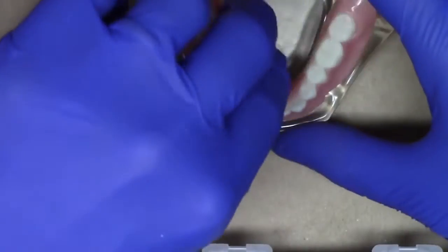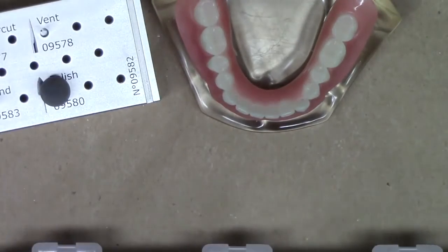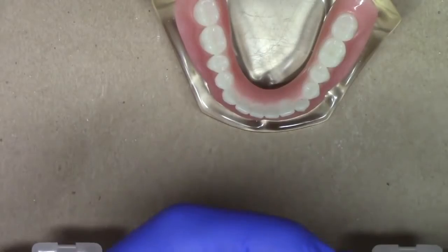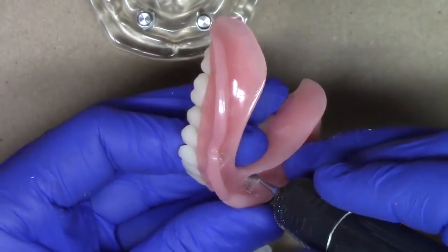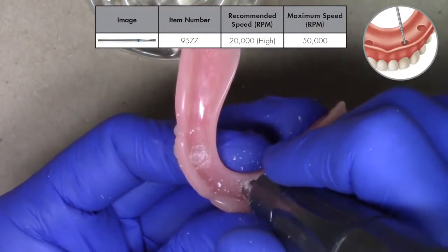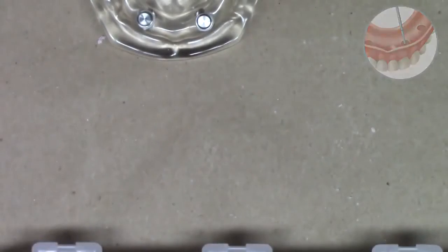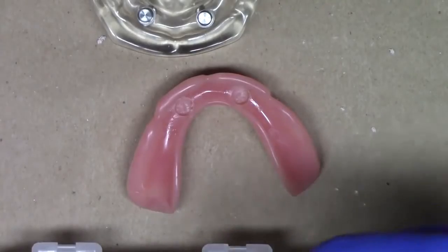Now at this point, we can go ahead and utilize our second burr, which is our recess undercut burr. We put back our recess burr, pull out our undercut burr, and prepare an undercut. Utilizing the undercut burr, also on high speed, I'm going to trace along the sides of the wall of the complete denture, providing mechanical undercuts and locking the chairside material into place. I have now used the undercut burr, also at high speed.